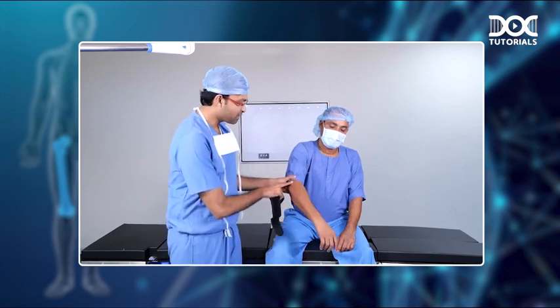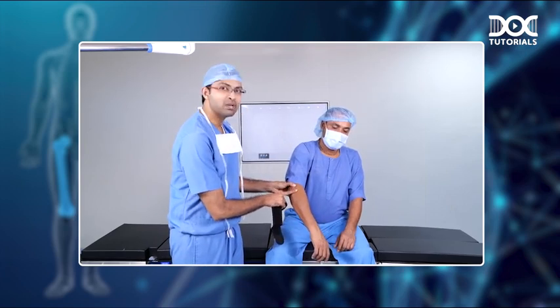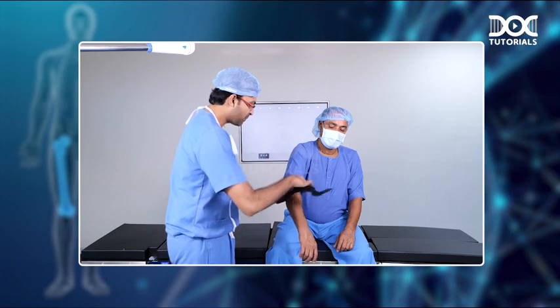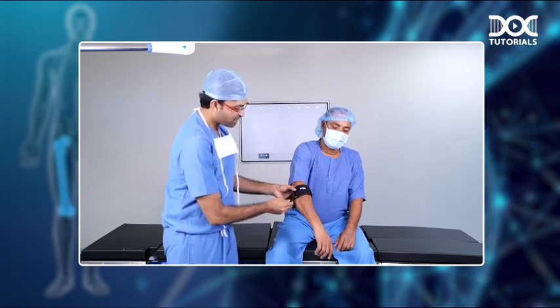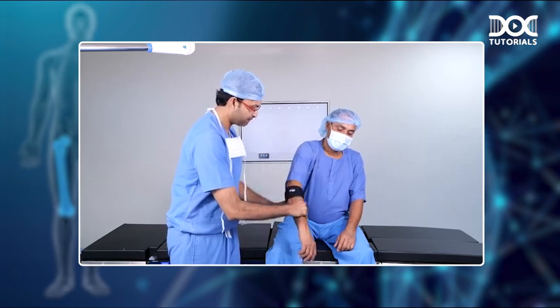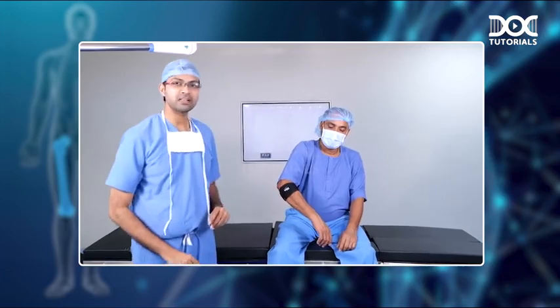If this is your lateral epicondyle, you have to apply the brace a little bit below it, probably 2 finger breadths below it. So instead of putting it right over the lateral epicondyle, we apply it just below it like this, and make sure the patient puts the brace snugly and tightly like this. Okay, so this is how you apply the counterforce brace or the tennis elbow brace.